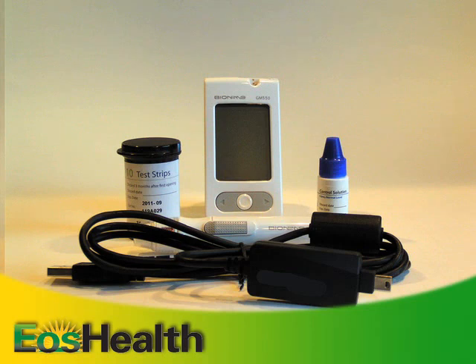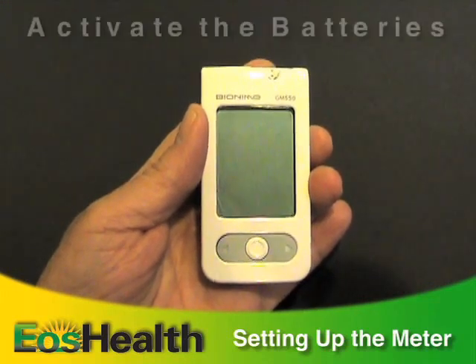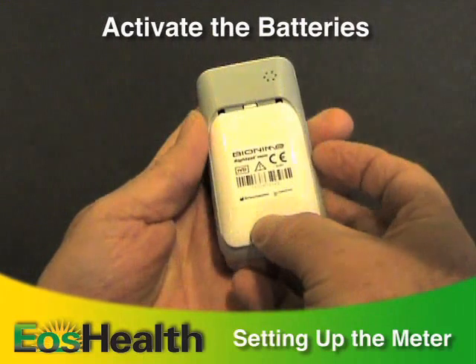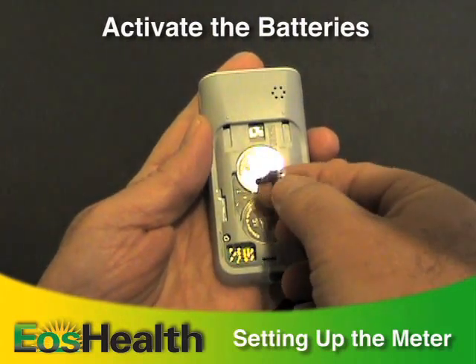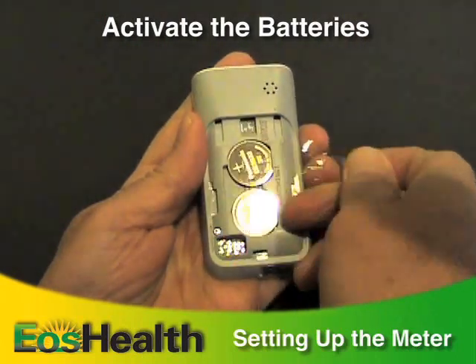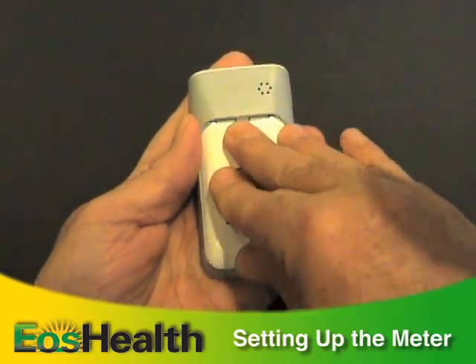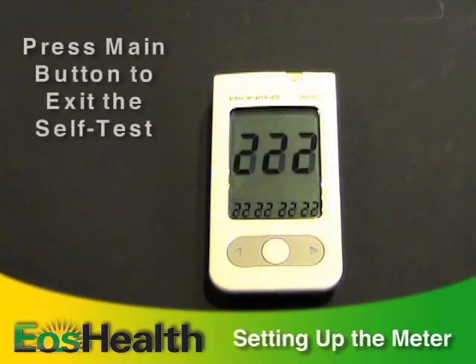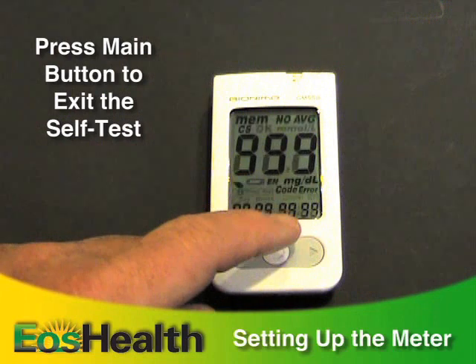Your meter comes complete with batteries, good for about 1,000 uses. The very first time you use it, turn the meter over, slide off the back cover, and pull off the plastic tape to activate the batteries. Then replace the battery cover. The meter will do a self-test.